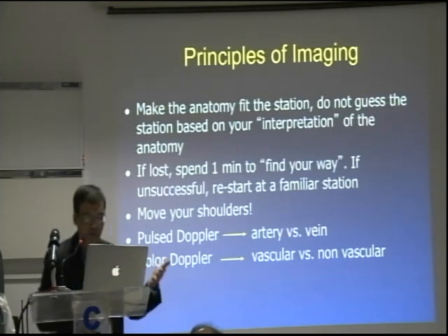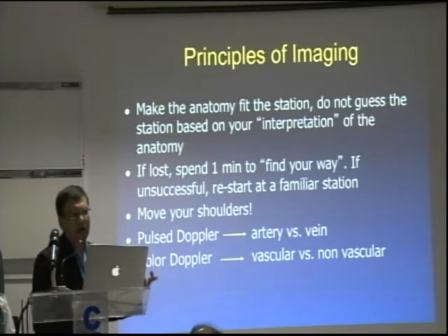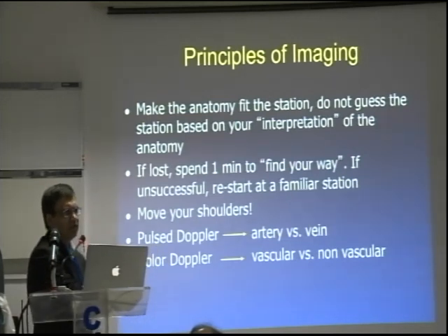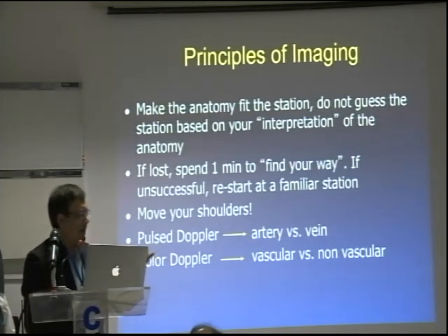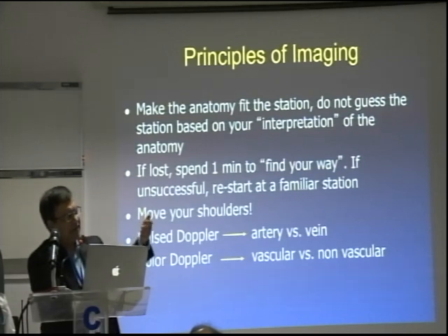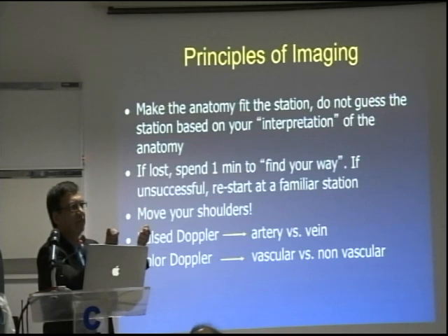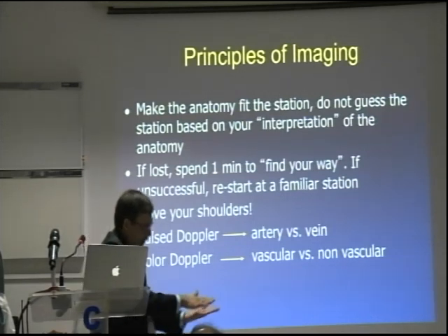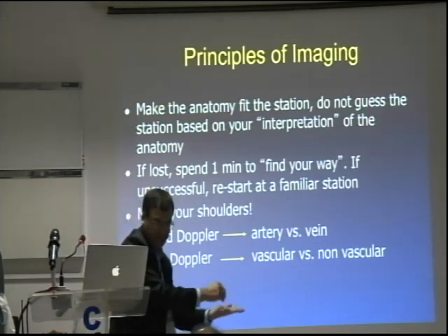And another thing is when you hold the scope, I don't know, even Mustafa, did you ever pay attention to the scope itself? The scope handle, the scope shaft, and the handle of the scope is always opposite to the transducer. If you put the scope straight on the bed, this is the hook, the limb which hooks to the machine.